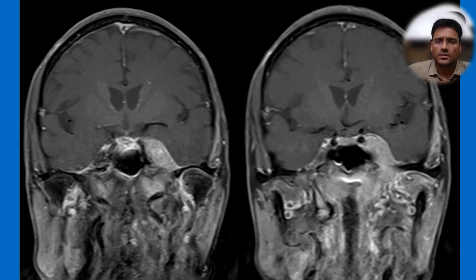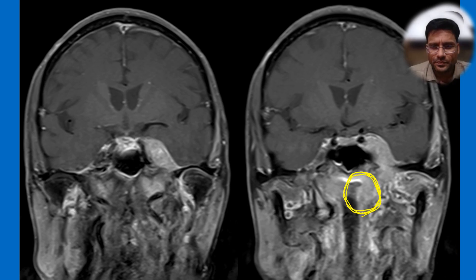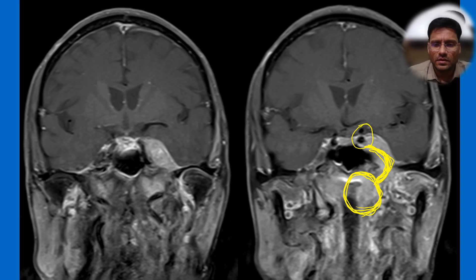The game-changing sequence was the coronal post-contrast images, where you can see the mass at the fossa of Rosenmüller which is contiguous with the mass in the cavernous sinus. When you see such contiguous involvement, the first thing to think in an elderly male is nasopharyngeal carcinoma spreading through perineural spread via foramina into the cavernous sinus. There is no obvious narrowing of the carotids, making this a clear-cut case of nasopharyngeal carcinoma spread into the cavernous sinus through perineural spread.